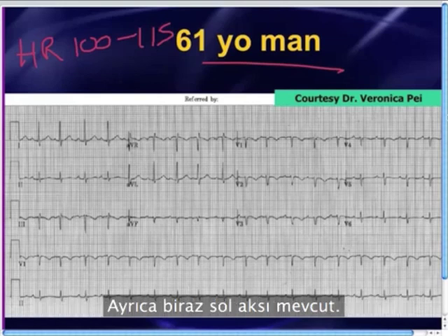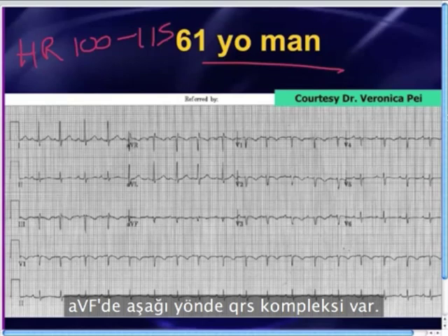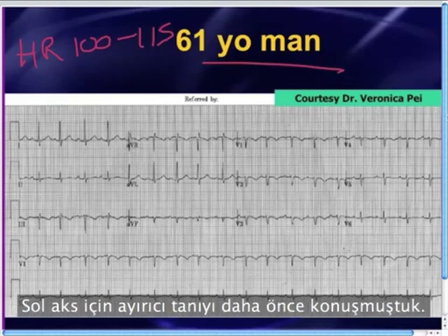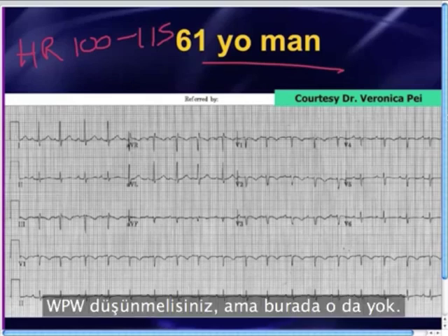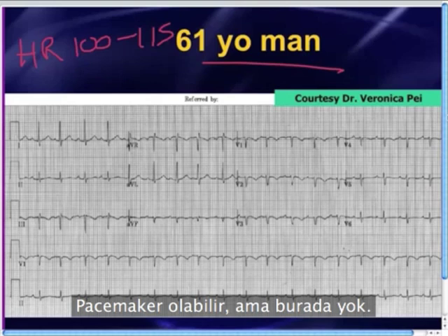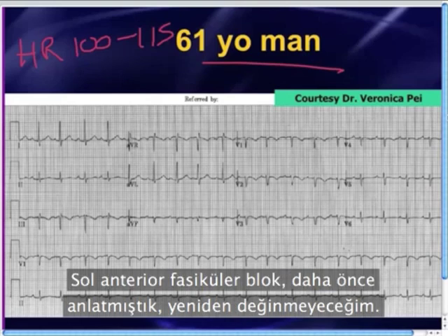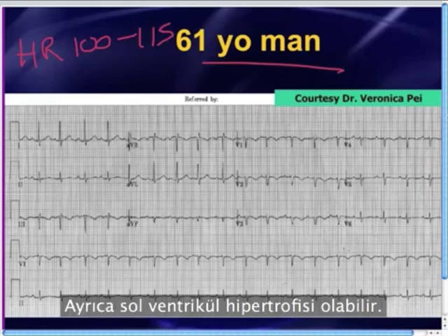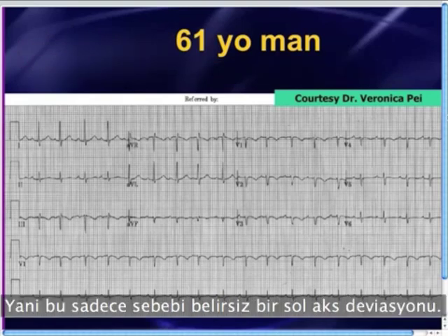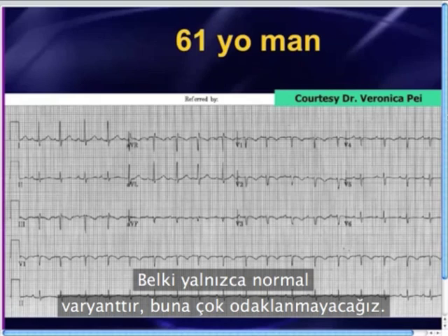He's also got a bit of a leftward axis — there's a downward QRS complex in AVF. We've talked about the differential for leftward axis before: left bundle branch block, which is not present; WPW, not present; pacemaker, not present; left anterior fascicular block, not present here either; and left ventricular hypertrophy, which doesn't appear to be present. So there's just a left axis deviation of uncertain cause — maybe a normal variant. We're not going to languish on that.